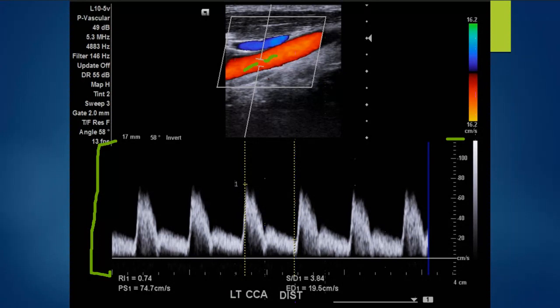Now you can increase your scale, and that would bring this scale up to 140, 160, 200, and so forth. Or you could decrease your scale so that your maximum value is 80 or 60, whatever you feel is appropriate for that waveform. Now, we could bring this limit down to 100 so that the top of our window would be about here.